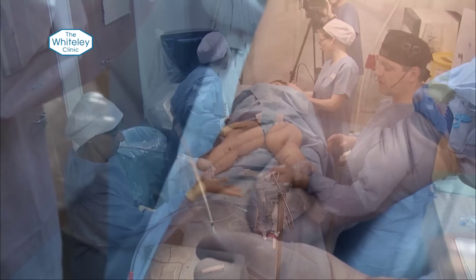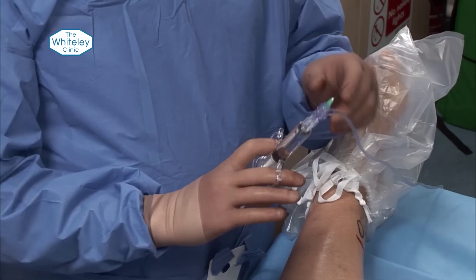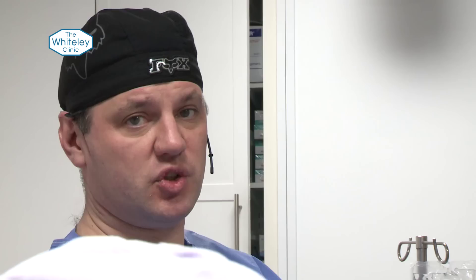This is an autofill syringe which makes life an awful lot easier. It gives 12 mils at a time through a green needle and it has a one-way valve. Every time you open it up it sucks tumescence in, and every time you inject it comes out through here — so there's no switching with a tap.